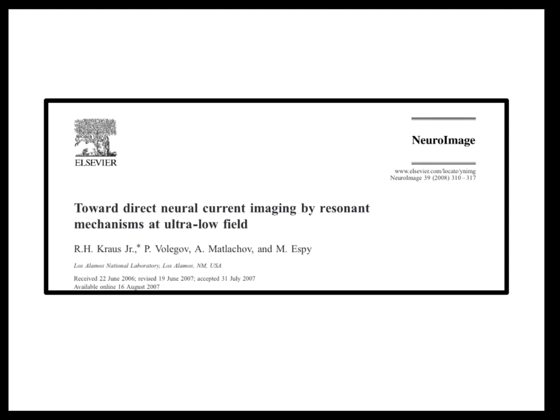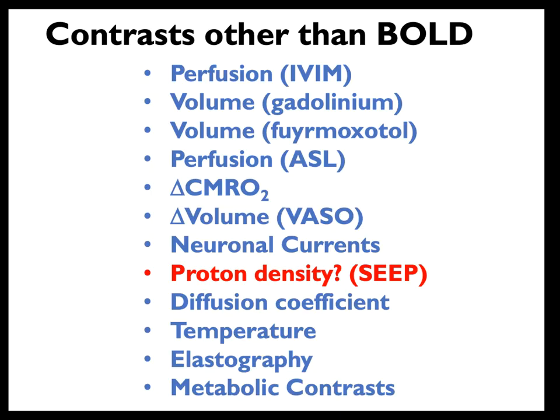People are even going way to low field, at 0.1 tesla or lower, because you don't need a high field to do this. It's not like it's a susceptibility effect. It's simply an additive field. And it's nice at low field because you're not seeing any BOLD then. So that's one of the problems. Okay, let's move on from there.